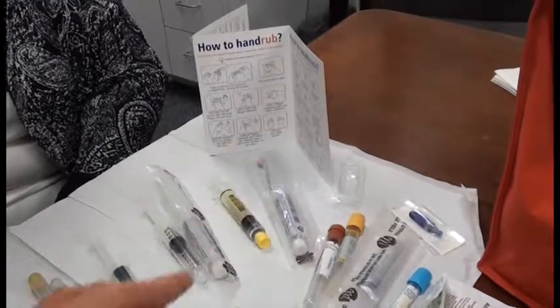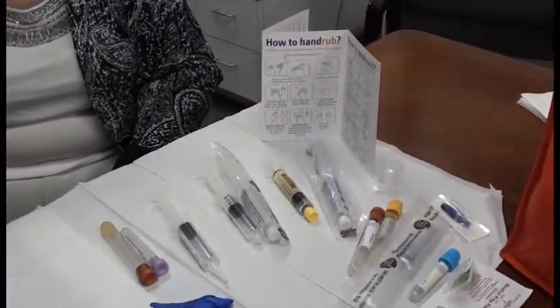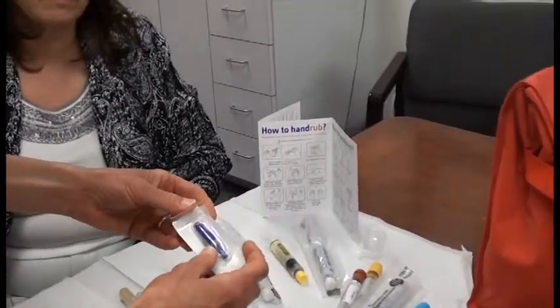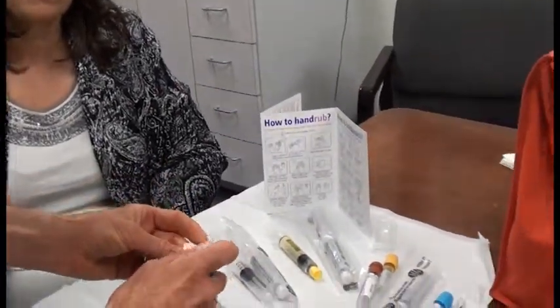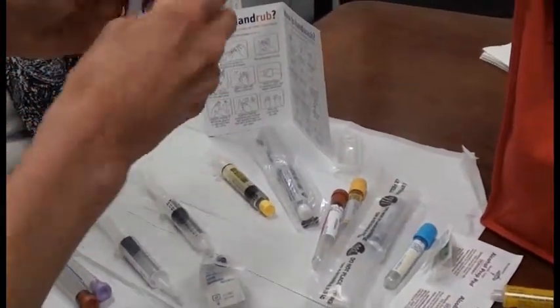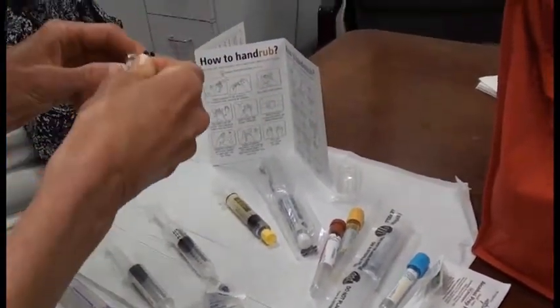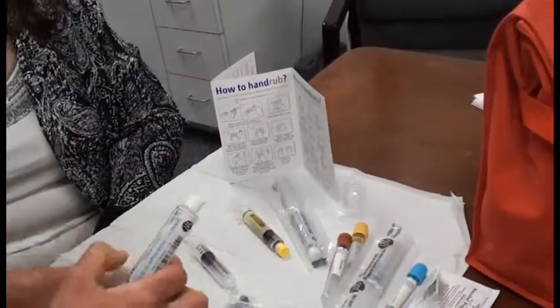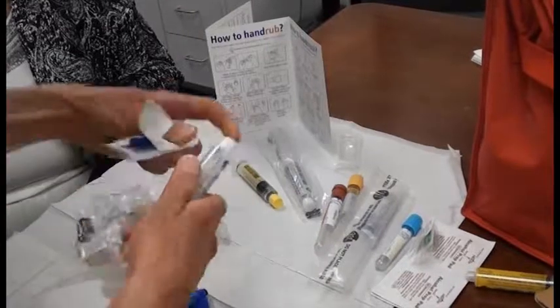So what I like to do before I get started is set up my cap change. Every lab draw requires a cap change afterwards. So I go ahead and take my second saline flush and attach my cap ahead of time, have it all flushed, ready to go.